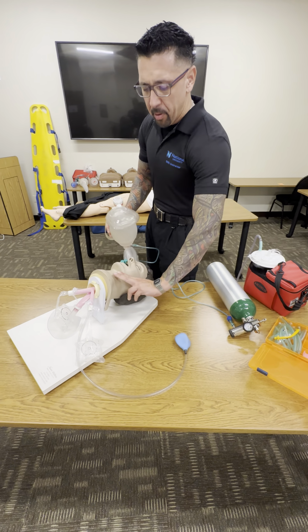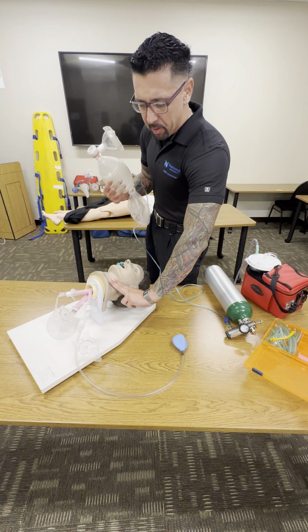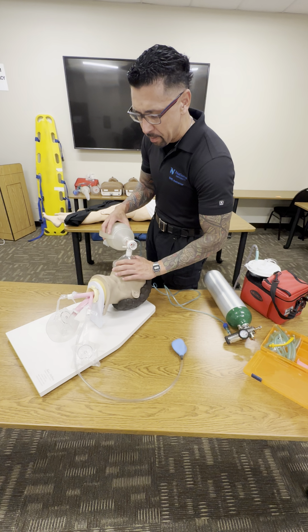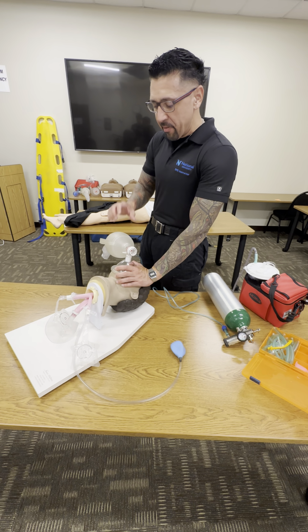On my own, I'm gonna check for a pulse, no less than 5 seconds to no more than 10. 1,000 3, 1,000 4, 1,000 5. We're to assume she still has a pulse. I'm gonna continue rescue breathing, 1 breath every 5 to 6 seconds.